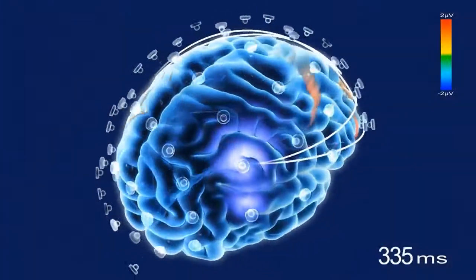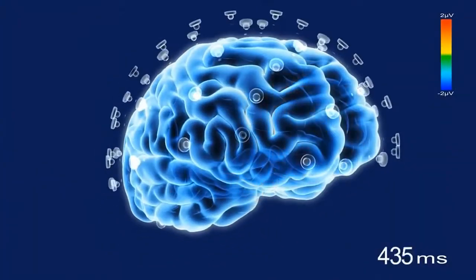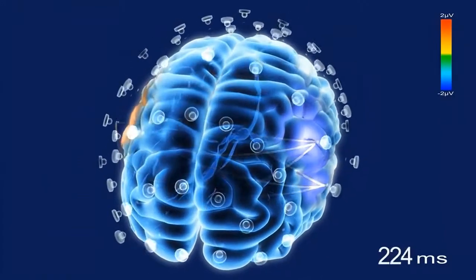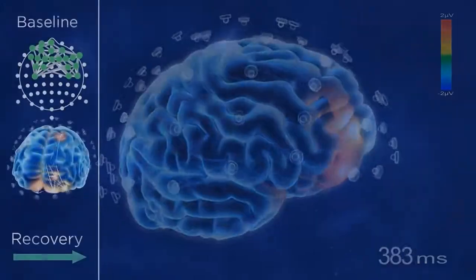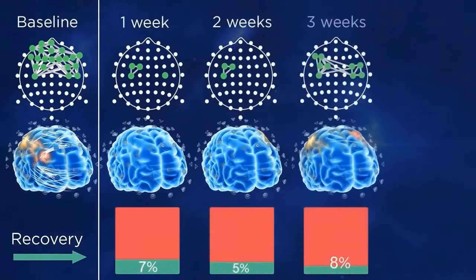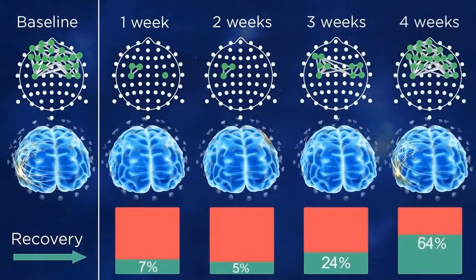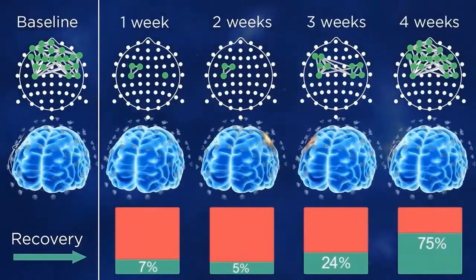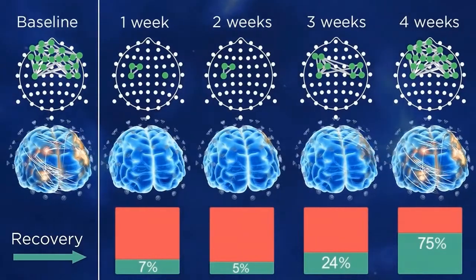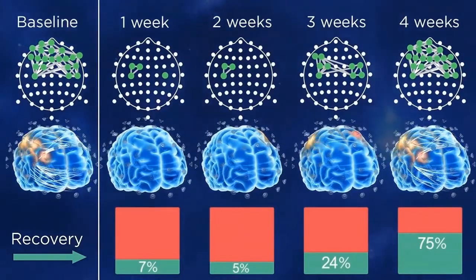So Alminda took that data we saw, just those lines, and converts it into this 3D image. Exactly, and this is the way how Winton's brain is processing faces. So what we see here is a 17-year-old boy from Pittsburgh, who is part of our clinical trials in the University of Pittsburgh Medical Center, and you can see on the left his baseline brain activity map, very similar to what we did to Winton earlier.